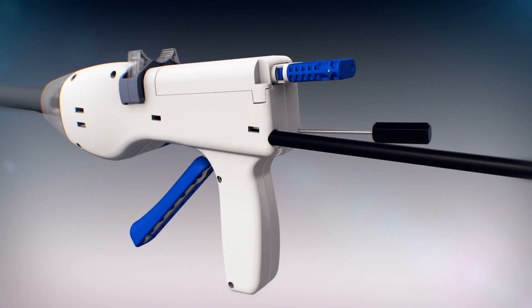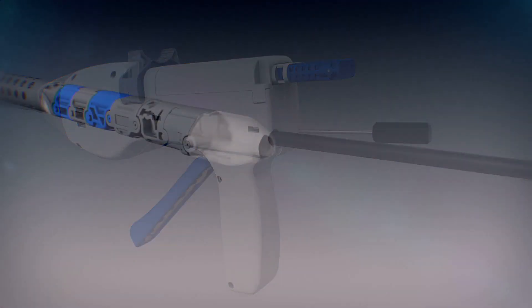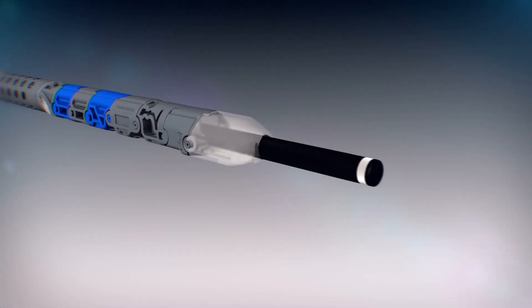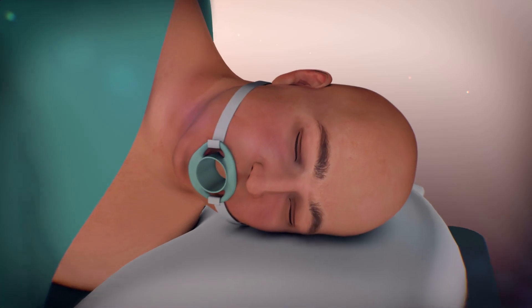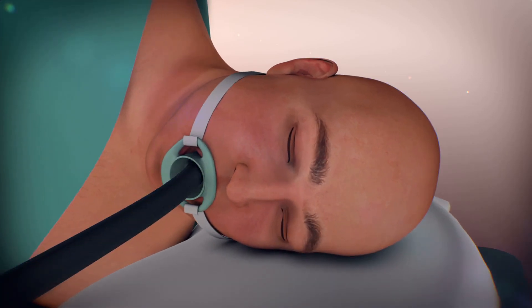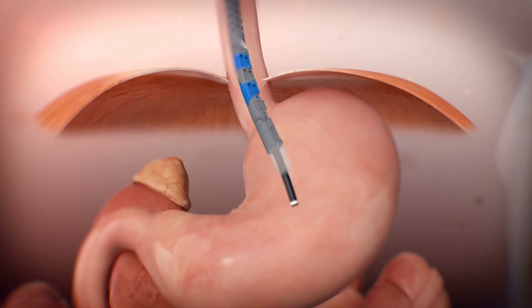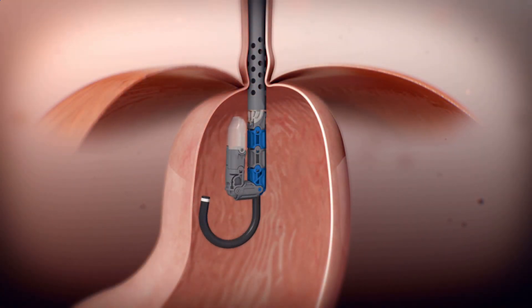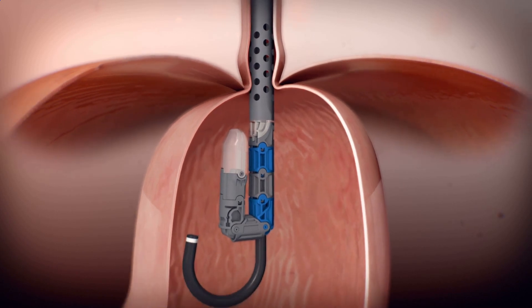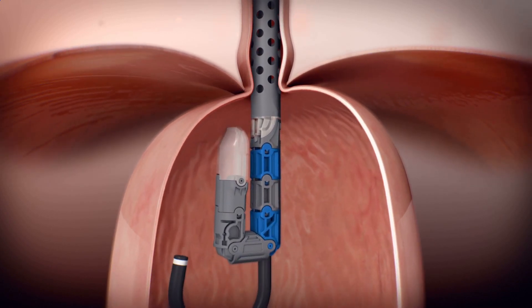An endoscope is inserted into the center channel of the EsophiX device and provides direct visualization for the TIF procedure. While under general anesthesia, the device and endoscope are gently glided through the patient's mouth and into the stomach. The stomach is inflated and the endoscope is advanced and retroflexed so that it is looking up at the gastroesophageal junction.